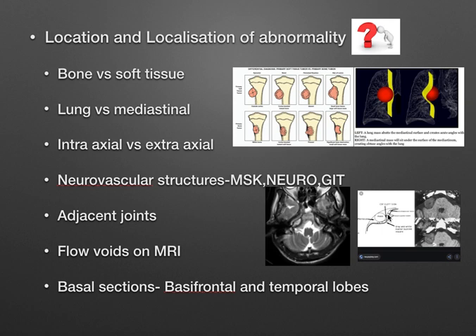Look at adjacent joints in musculoskeletal cases, and always look at flow voids on MRI. Here you can see a normal left segment showing a normal blackish appearance — a normal flow void. On the right side, the flow void is lost, indicating occlusion of the right ICA. This clues the cause of infarction and tells the clinician where to look and what can be done further. Flow voids are very important — not only in brain but also in abdomen, peripheral joints, and limbs.